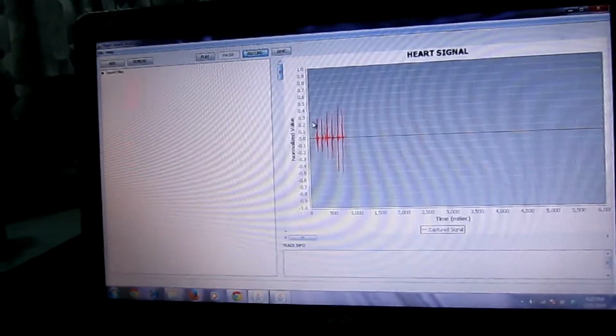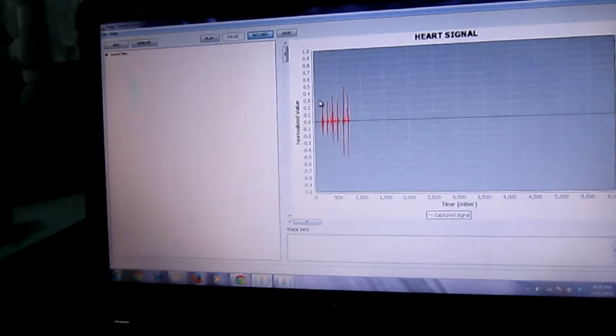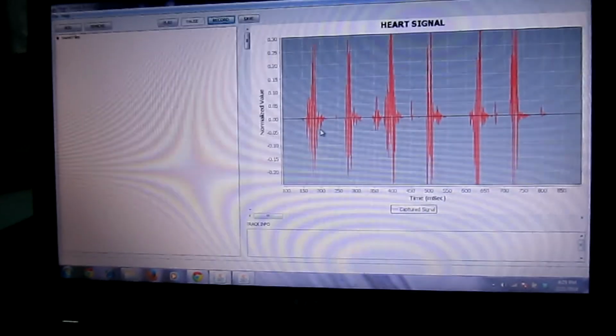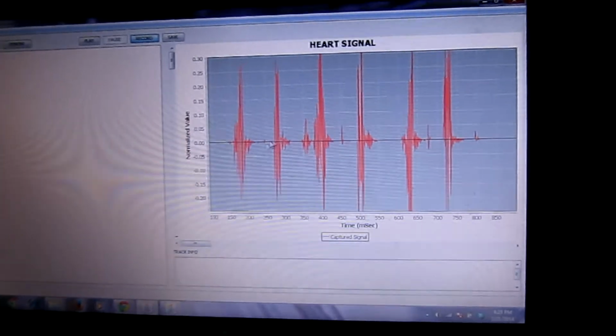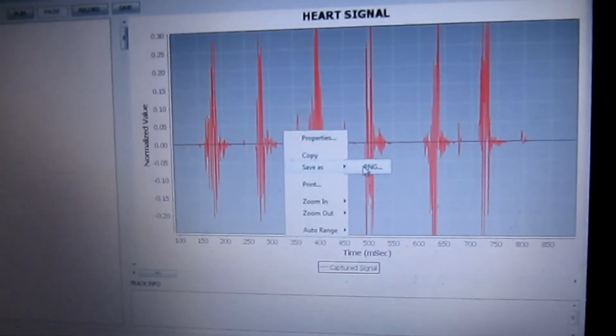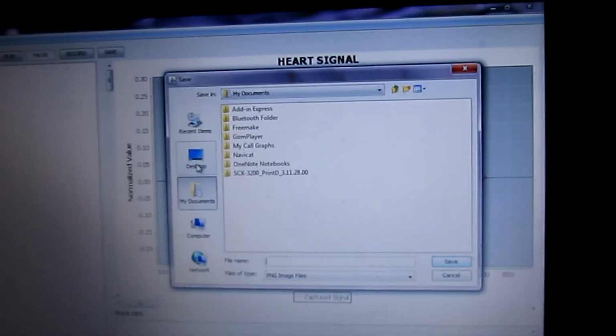So we have the waveforms here. We can select the portion that we want to highlight. Here it is. We can also save it as an image.